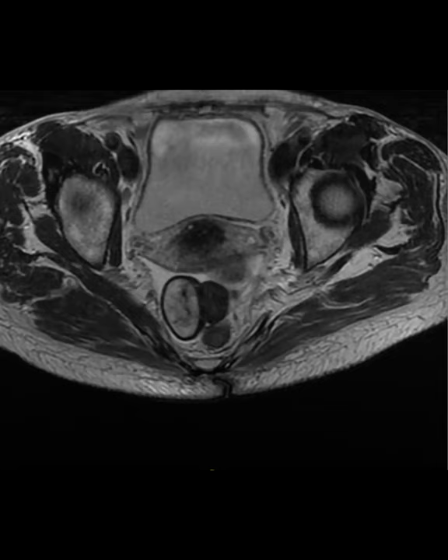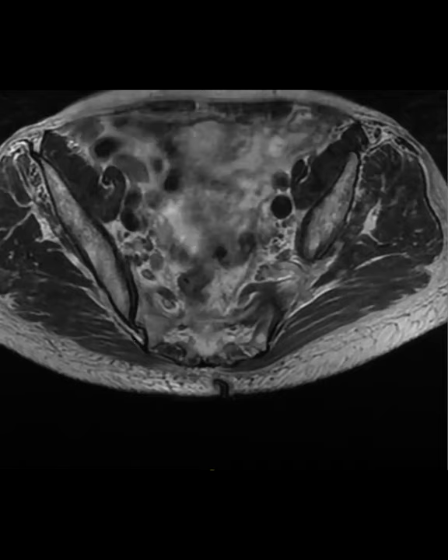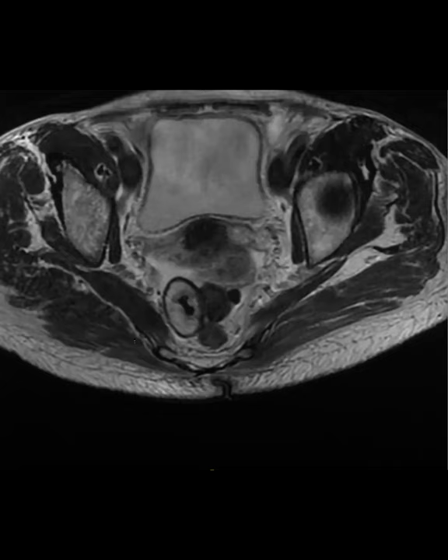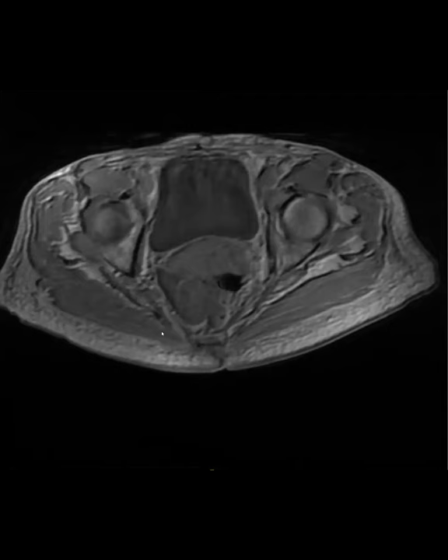So it's not attached to the ovary, so it's not a dermoid, but dermoids are adnexal, right? Yeah. You can have mesenteric, but if you're going to call it a dermoid, it has to be associated with the adnexa. Oh, gotcha. So how would you classify this? I would just call this a degenerating fibroid. Because it's attached to the fibroid, which is attached to the uterus. Another thing I was thinking, along the lines of teratoma, is a perirectal teratoma, but that would be weird for this, right? I guess you're going to have to decide on your own. If you think it's attached to the uterus, then it's uterine. Right, there's no differential at that point.